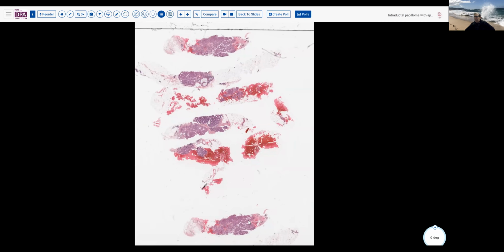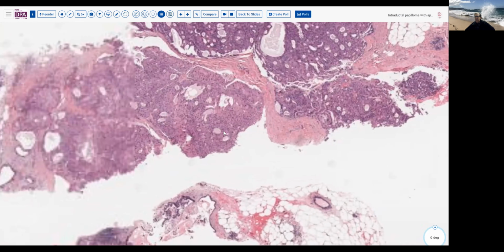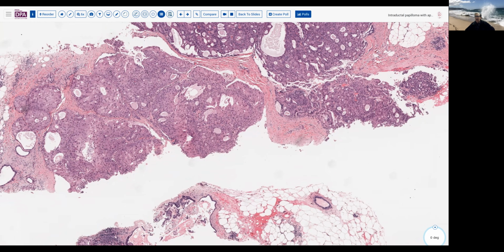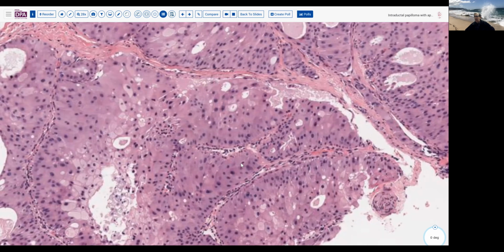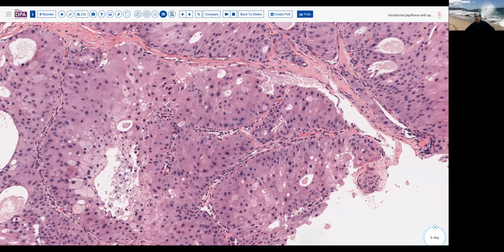So let's take a look at this tumor here. We see some solid tumor areas. We'll go down to a little higher magnification. And I think we'll be able to identify that these cells have quite abundant eosinophilic cytoplasm. These tend to be pink tumors. And notice here that there's so much cytoplasm, it's almost hard to find the nuclei in some areas. Now, this is an example maybe of a lower grade tumor, but we still have some degree of nuclear pleomorphism, wonderful macronucleoli, and we're forming a solid pattern.